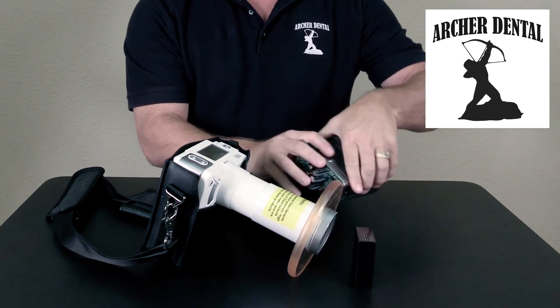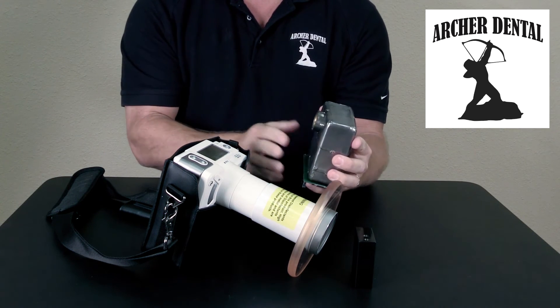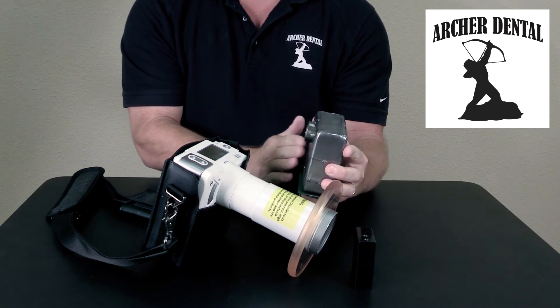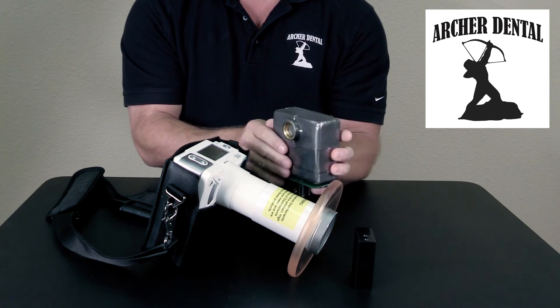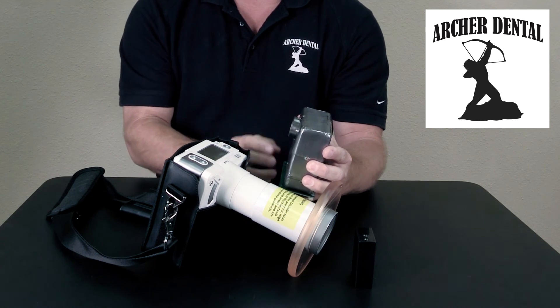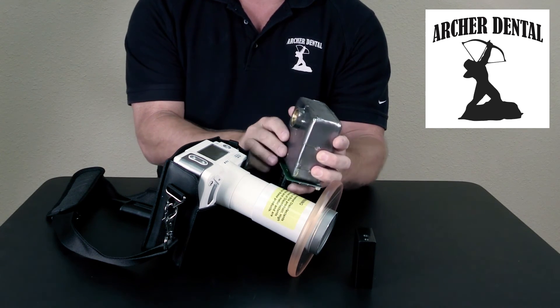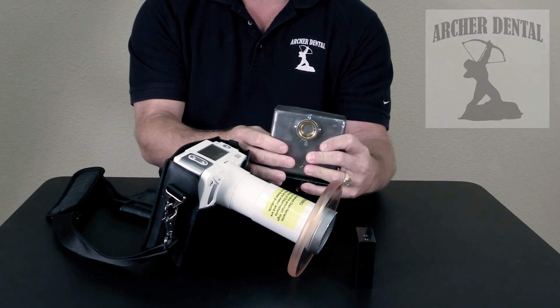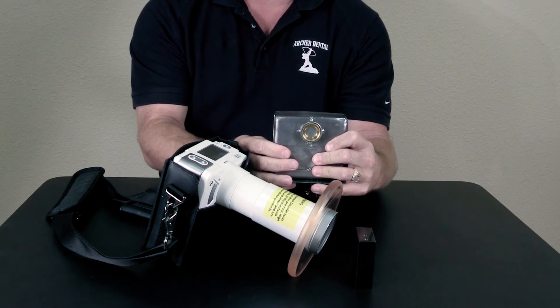These units also feature an oil-cooled, double lead-lined tube. Unlike other units on the market that are air-cooled and need 8 to 10 seconds to cool down before taking a replacement shot, these units don't. You can take immediate back-to-back shots, just like the more expensive wall-mount units normally found in a dental office.